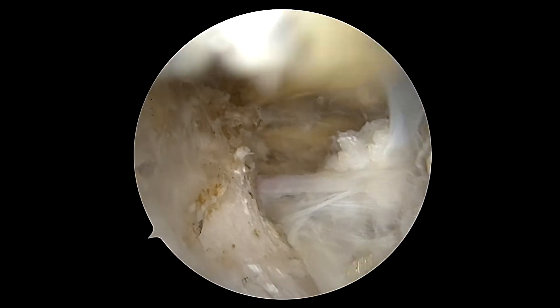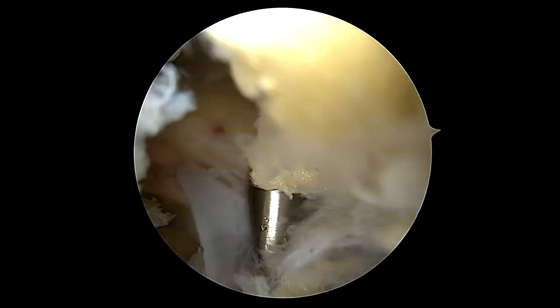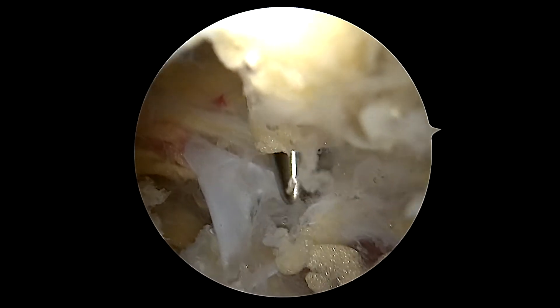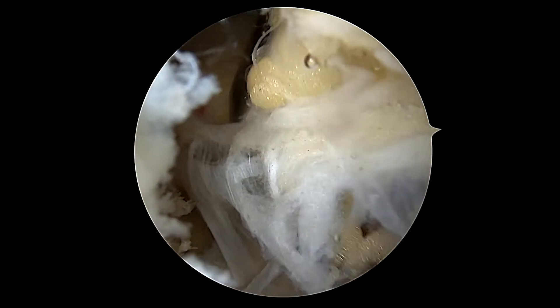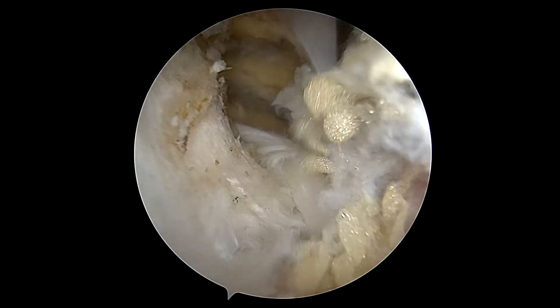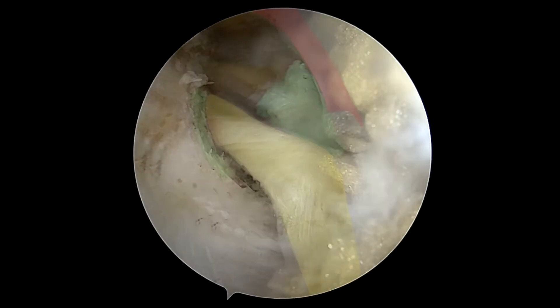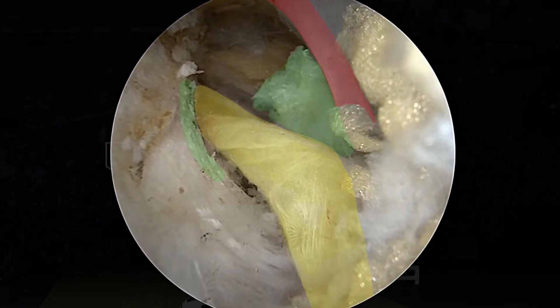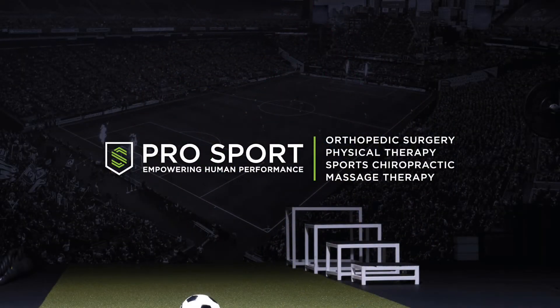Here we can see a complete release. The artery above is moving freely with no area of compression, and below that we see the suprascapular nerve, which I can move around to confirm there's nothing tethering it in any way. That completes our case — hope that's helpful. This is Nell Sampatacos, take care.